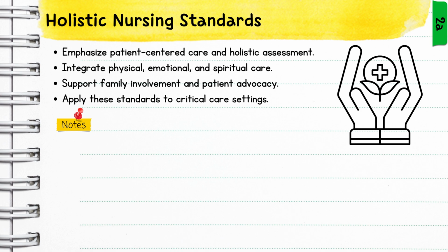Okay. Why this is in here is oftentimes, these are more invasive monitoring, and you might have patients and family members that just don't want to be poked anymore. And so you need to educate them fully on why we need this extra monitoring. Without this med, like your blood pressure, we need to be able to monitor that. We need to place an art line because of this. And so it's important to understand these things when we're explaining why we're doing things, right?